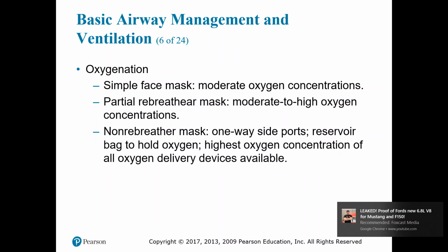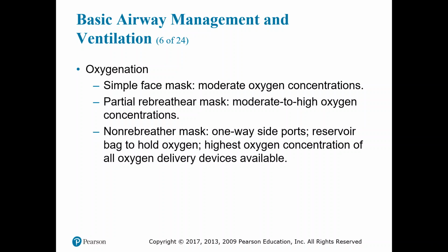So when we put the patient on a non-rebreather, we want to make sure that reservoir bag is full before we put it to their face. You reach in with a gloved finger and cover the port, allowing oxygen into the mask, and you force it down to fill up that reservoir bag. Then you place it on the patient and watch and adjust your flow so that the bag does not completely deflate. If it completely deflates, then you're not providing enough oxygen for them. We only want about 50% deflation.